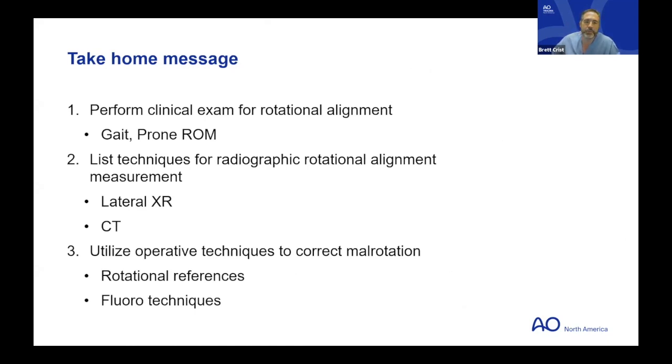As far as looking at rotational alignment, I really prefer the lateral x-rays. I think my eye sees it better, and I'm still not perfect for sure. CT scan is the best. I haven't done any of the intraoperative 2D, 3D fluoro that gives you a CT scan equivalent, but that would mean 2 spins, just remember. So 1 at the hip and 1 at the knee.